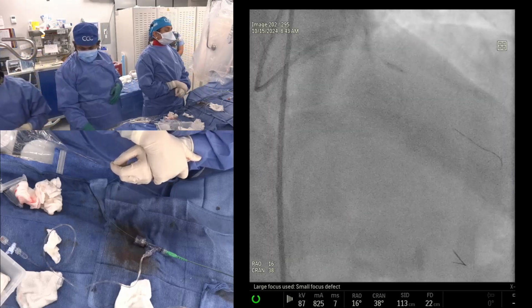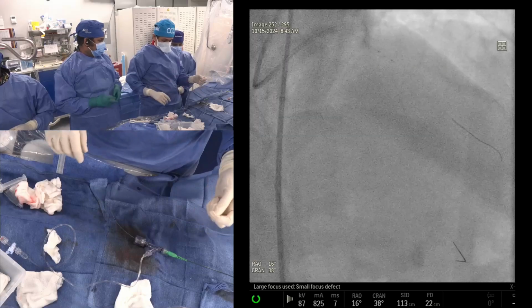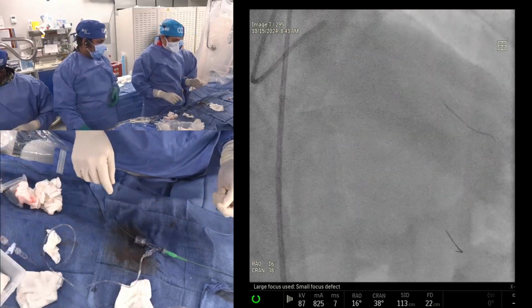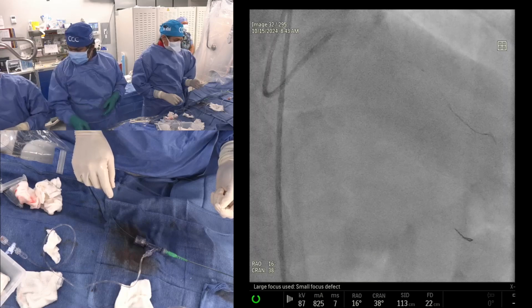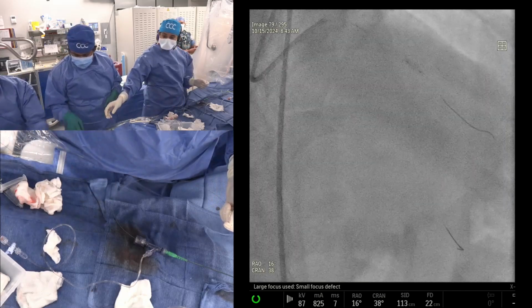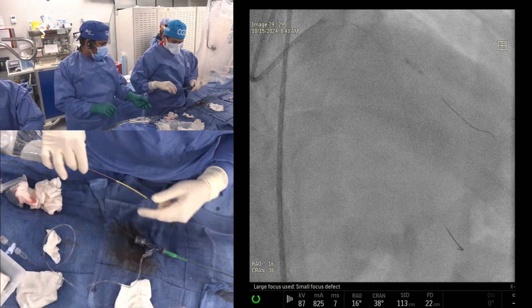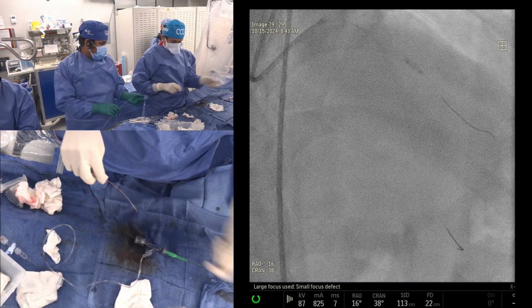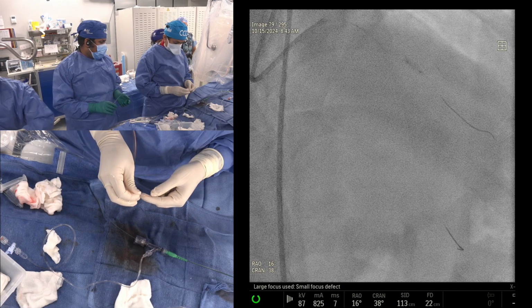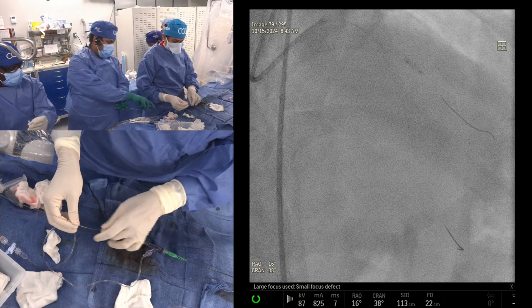We would be calling it a mini crush. Let's go with a step crush approach? No, we'll try to see if we can do a mini crush with a 6 French. It will go. The only thing is the 48, because length-wise it may give a little trouble, but let's see. On the 6 French, I am a big believer. Even the Boston Scientific company can't say that two Synergy stents can go through a 6 French, and I showed them the example.